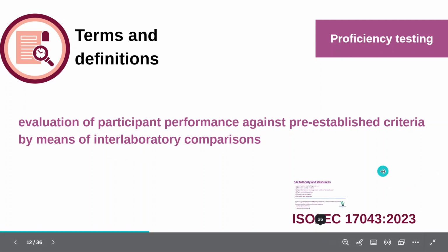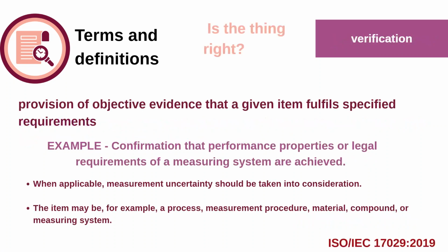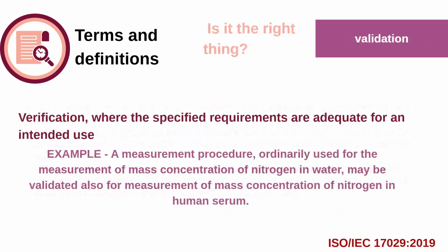There is an ISO exclusively for that, which is ISO 17043, where they have completed a proficiency testing and they will have a standard sheet. So we will compare our value against that standard sheet, instead of comparing against another machine's output. That is ISO 17043.